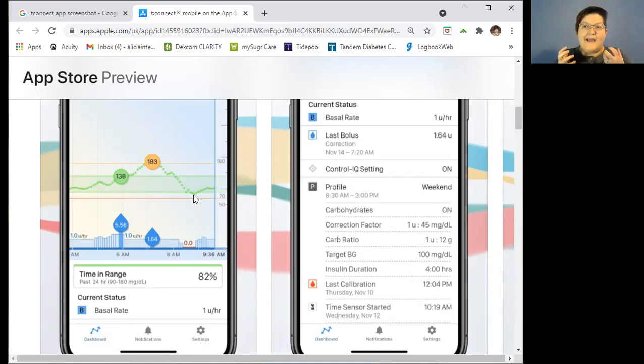So it pulls back all my basal, and instead of parking, I come down and the aircraft carrier isn't there anymore. So what do I have to do? I have to then throttle up back into the sky. And that's what our blood sugar does. We come down and we bounce, and then we sit at 140. And we're so frustrated, especially those overnights. Dinner comes down too hot and fast, we bounce up and we sit at 140 all night. And the system's fine letting us sit at 140 because it's not going to engage to change it unless we look like we're going above 140. And if I'm sitting at 137 all night, I don't ever get that extra help to get back down.